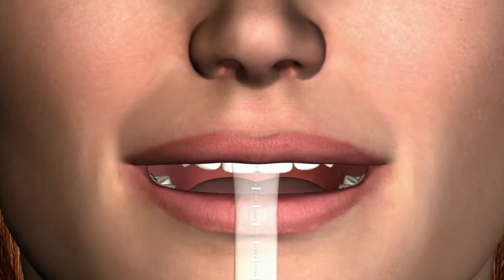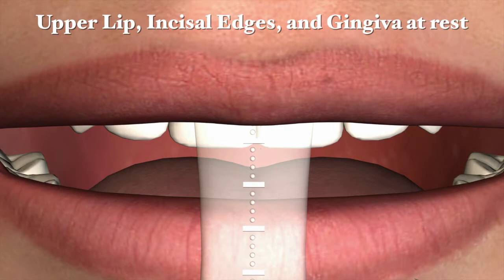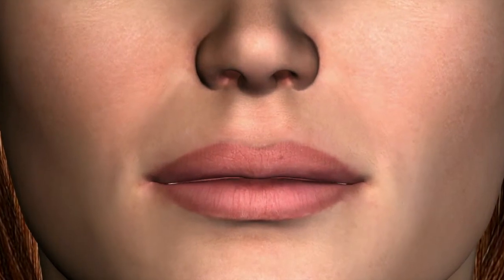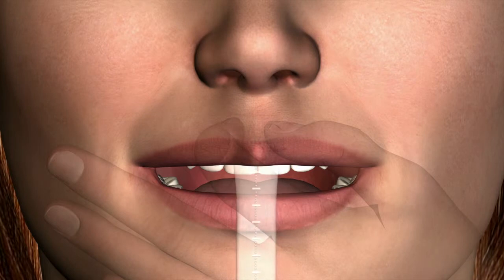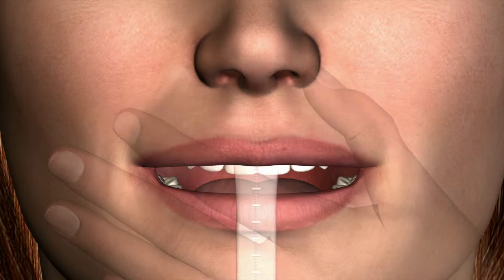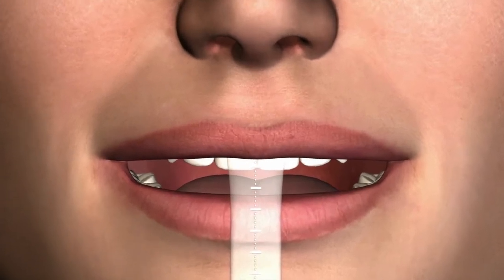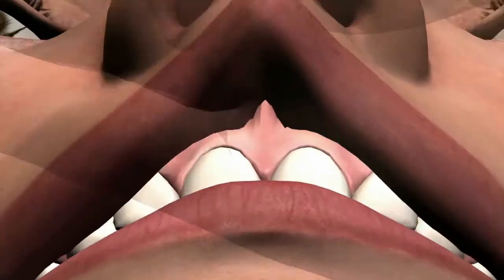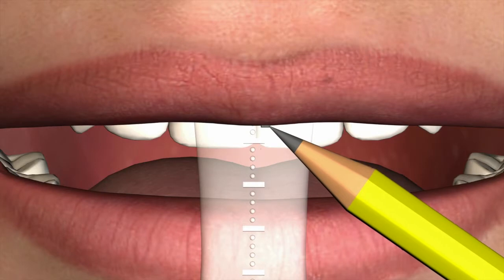Step-by-step instructions — Dentate usage: Upper lip, incisal edges, and gingiva at rest. Ask the patient to open the mouth with teeth apart and to hold that position without flexing any facial muscles. Place the long end of the ruler, centered, in the full depth of the maxillary anterior vestibule, taking care not to compress the vestibular tissue. Note the notch in the ruler will be placed over the anterior frenum.